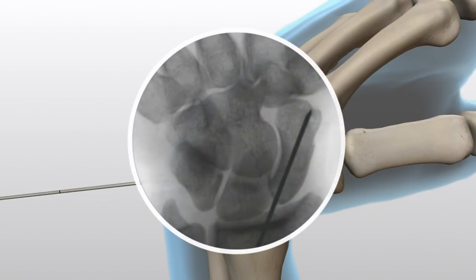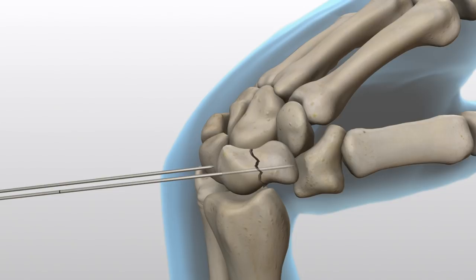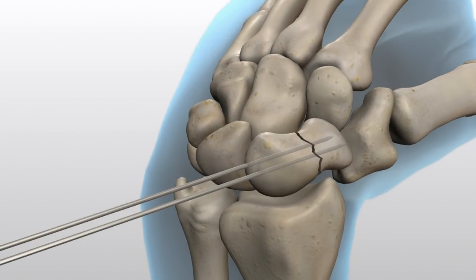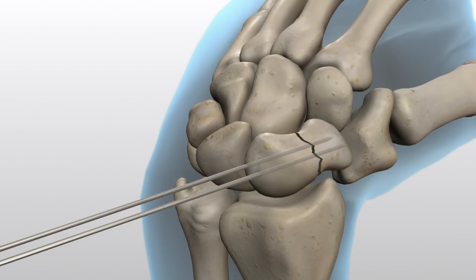A 0.045-inch parallel wire guide is available and may be used to assist with the placement of a second 0.045-inch guide wire if needed. A second guide wire is recommended to help maintain reduction and rotational stability.